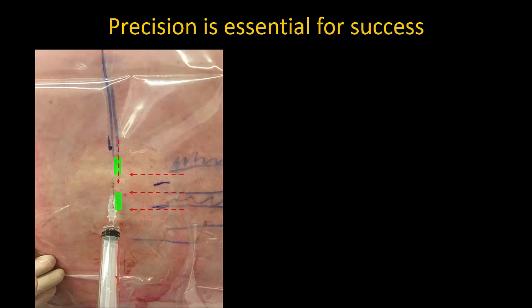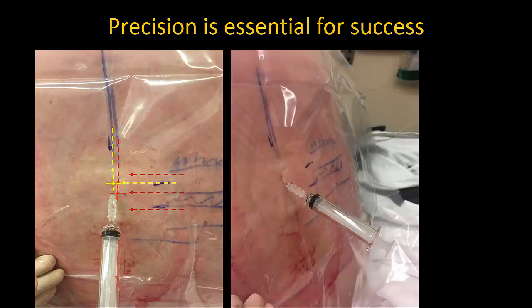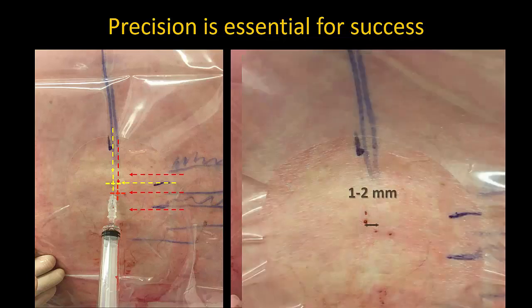However, there was a surgical delay, so he was allowed to lie back down and was later set up again for the spinal. Initial attempts using the original markings were unsuccessful because the skin was now in a slightly different position. We re-scanned as a rescue and determined the new position of the midline and interlaminar spaces. He also had narrow spaces which required quite a large degree of cranial angulation as well for entry. But what is important is that you can see that the difference between failure and success is minimal.